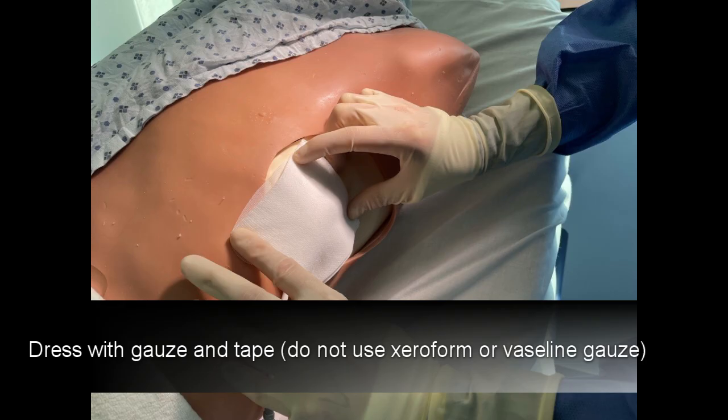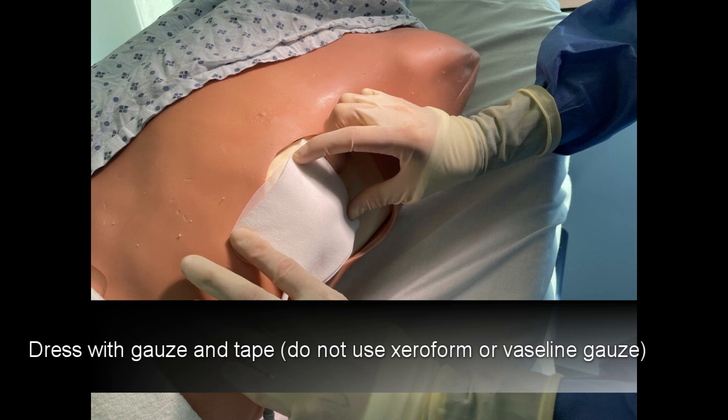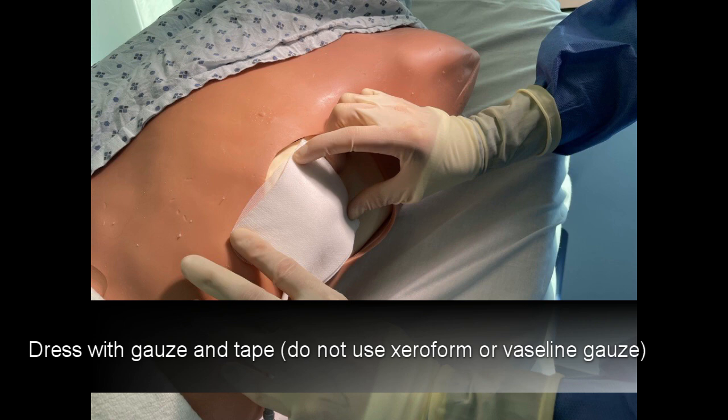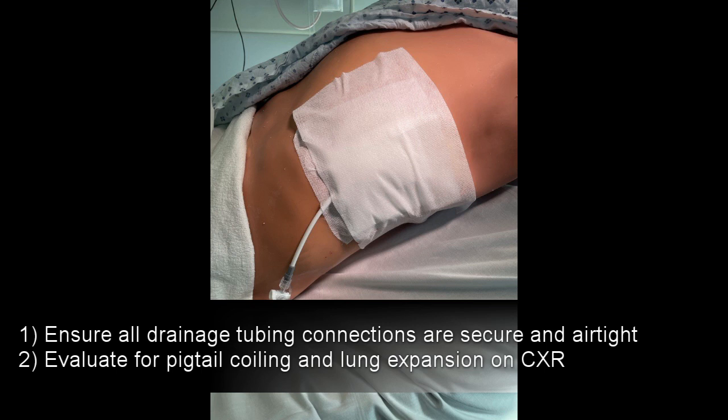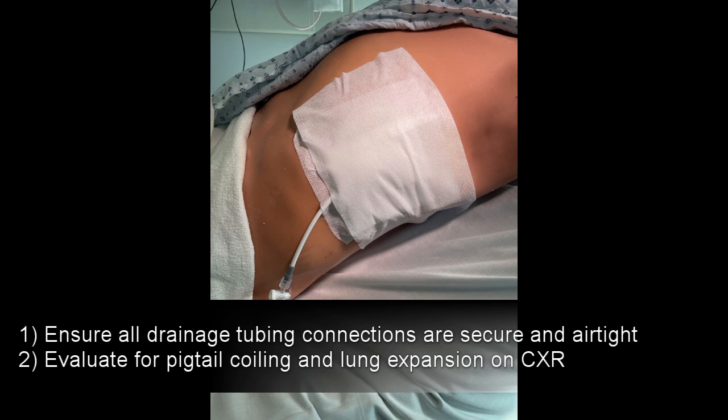Once the pigtail is secured, dress the insertion site with gauze and tape. You should avoid using xeriform or Vaseline gauze as this can dissolve the adhesive on the statlock. After you've applied a dry occlusive dressing, obtain a post-procedure chest x-ray to confirm appropriate tube placement and assess for lung re-expansion.